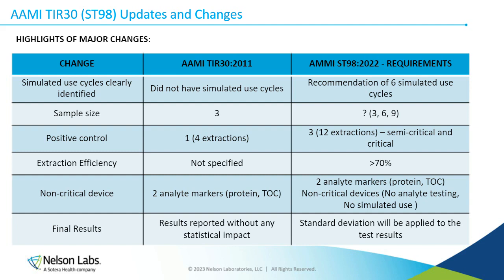Non-critical devices: this is a plus for everybody, where we used to do analytical tests for non-critical devices. These are devices that I showed you in my previous slide, such as surgical lights, stools, and bed IV poles. For those we used to do protein and TOC. However, it's not required.